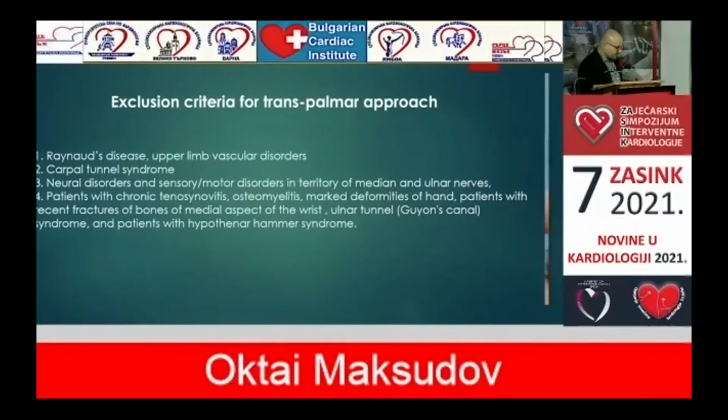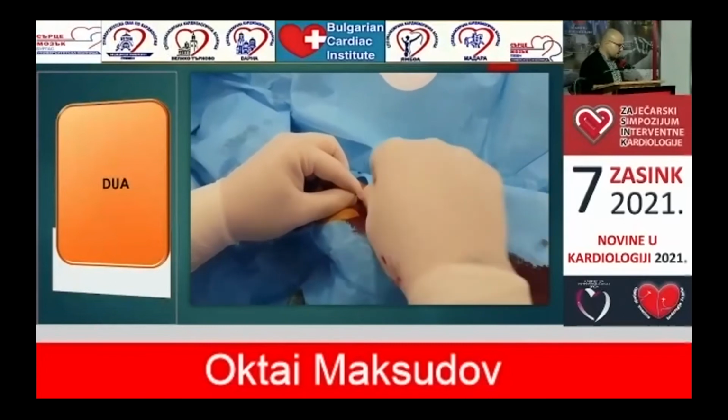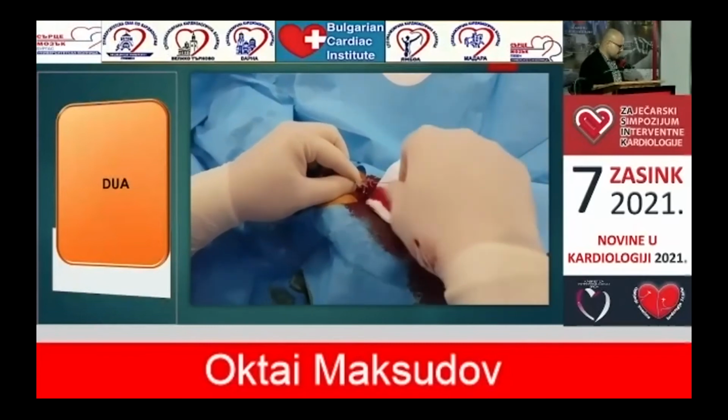So this is the puncturing and how the blood flows. This is how the needle goes. It goes very easily, smoothly.